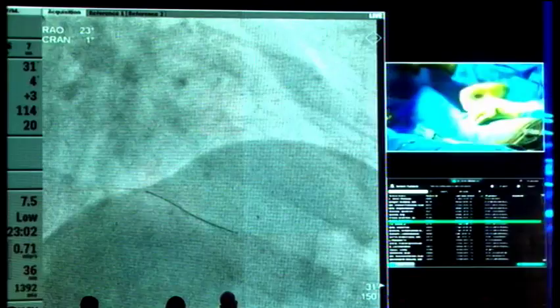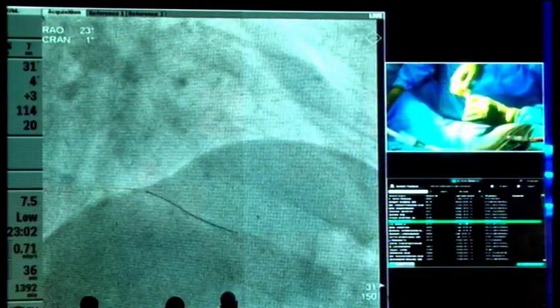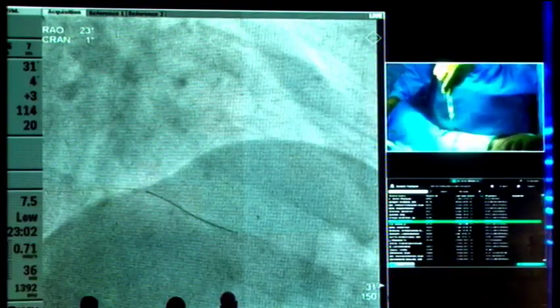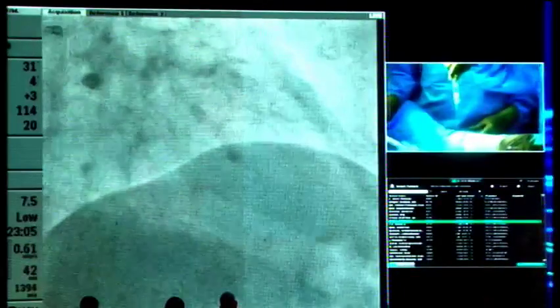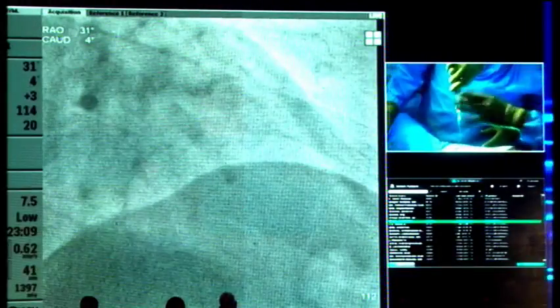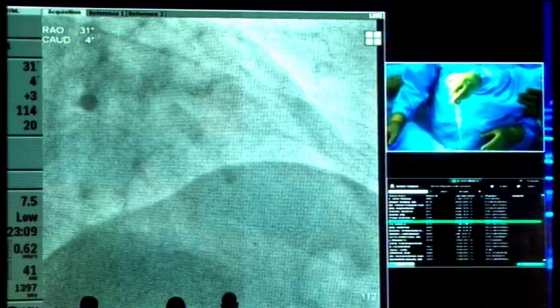Yeah, maybe another man's procedure is always easy to understand, except for the operator. So most of the time we are under pressure, and every time we advise the other friend. It's very nice, yeah? Okay, double zoom it. But it's very difficult to get the blood back. So the tip is almost in a wedging position here.